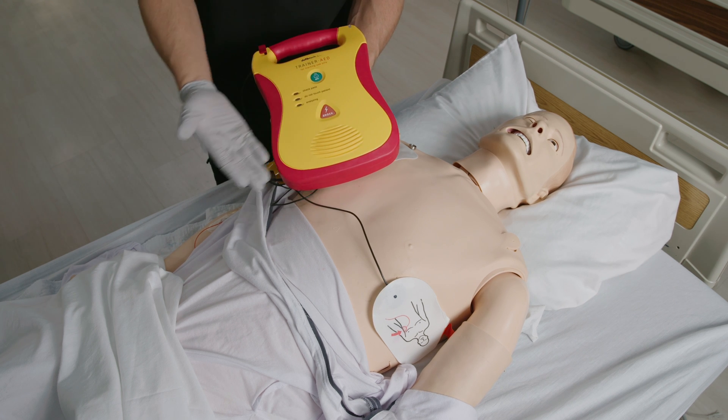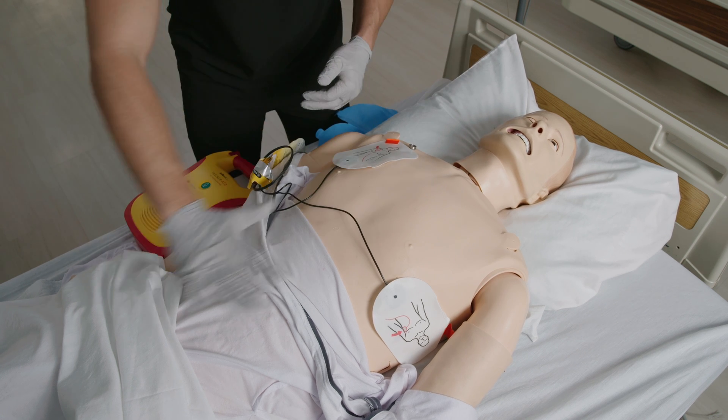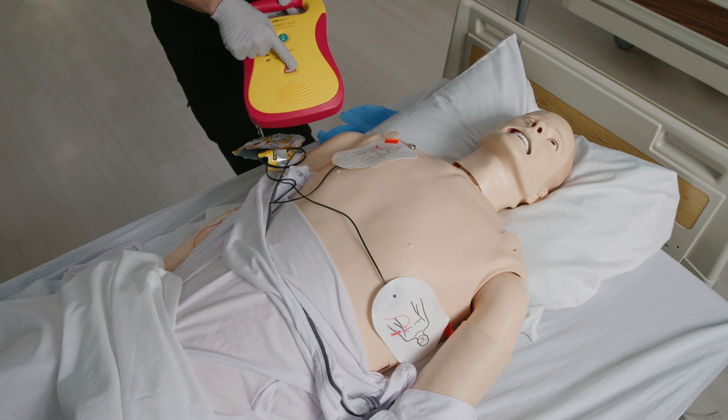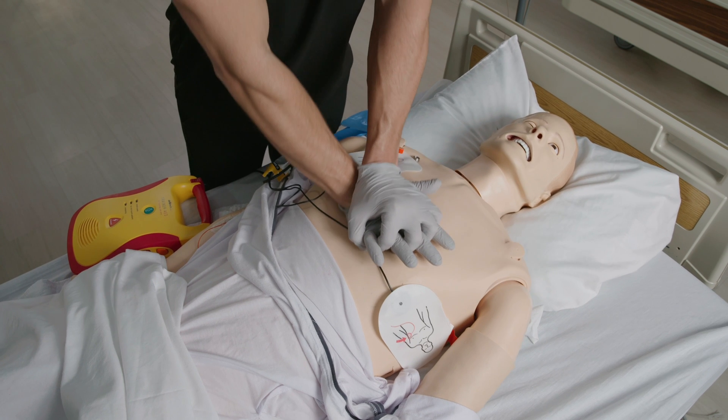Plug the pad connector cable into the AED if necessary. Let the AED analyze the heart rhythm and make sure no one is touching the person, and say 'clear' in a loud voice. Push the shock button when prompted. After the AED delivers the shock or if no shock is advised, immediately restart CPR beginning with chest compressions.